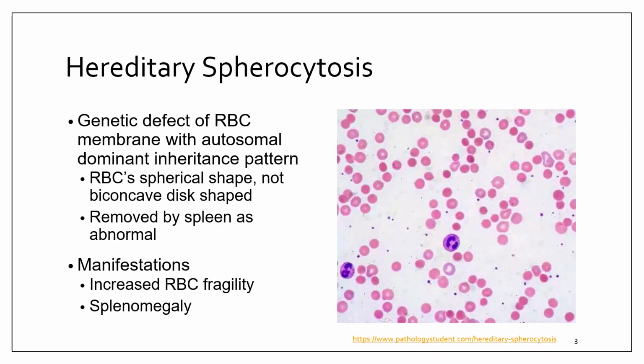Hereditary spherocytosis is one of the few conditions where you can often make a strong presumptive diagnosis from the blood smear alone. If you see numerous spherocytes, no central pallor, and evidence of hemolysis, you should immediately think membrane defect, not hemoglobin defect. Some worthless but useful knowledge: spherocytes are also seen in autoimmune hemolytic anemia, but HS equals inherited membrane problem, and AIHA is antibody-mediated membrane damage. Different cause, same shape. That's why clinical correlation always matters.